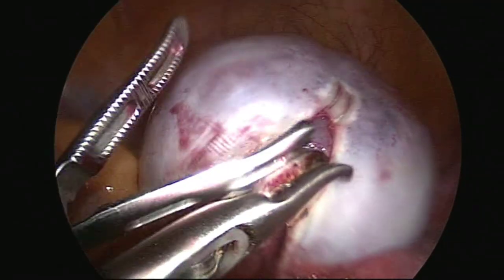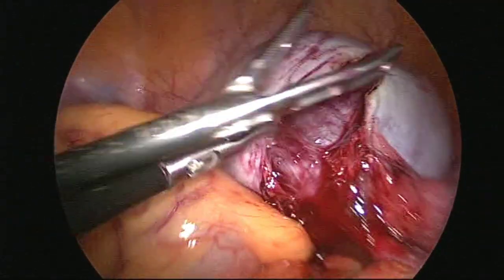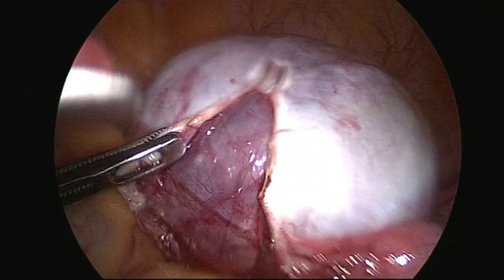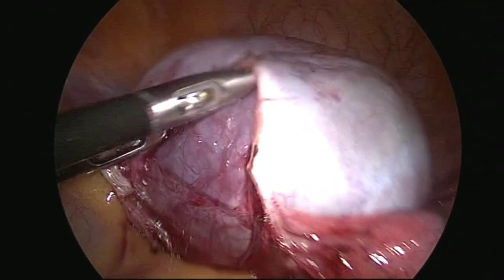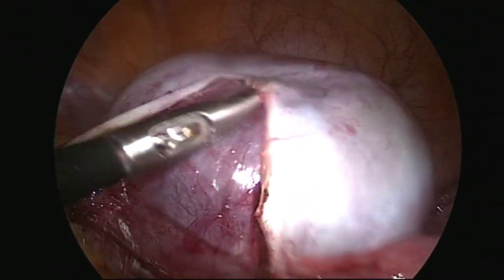After reaching the right plane, there is no difficulty at all. I have to just separate and then cut.